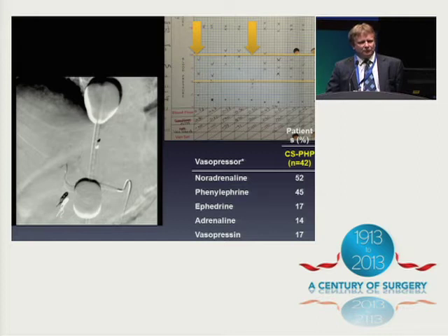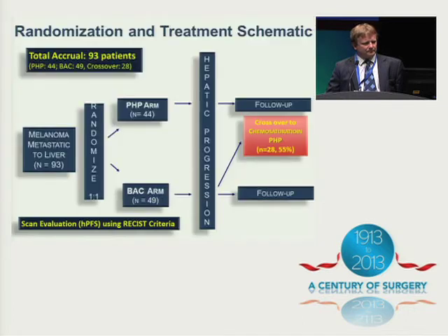And the patient systemically doesn't enjoy being on this filter. The pressure often crashes down, the systolic down to 30 to 50 when you're on the filter. So it's a major physiological insult, and your anaesthetist needs to be on the ball with syringes full of various vasopressors. But it's not quite as hairy as it sounds, and it is entirely manageable.